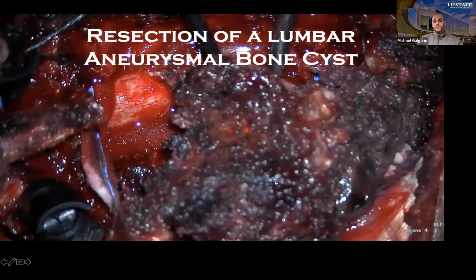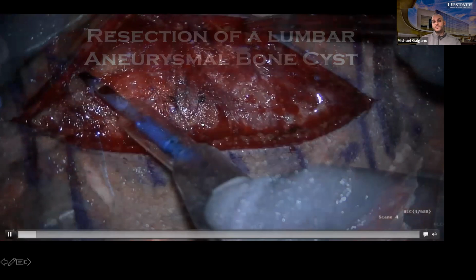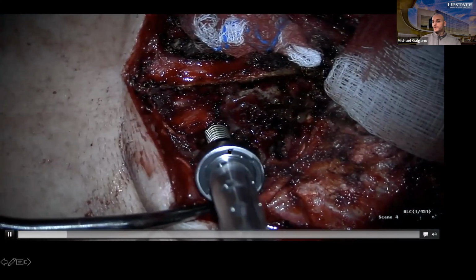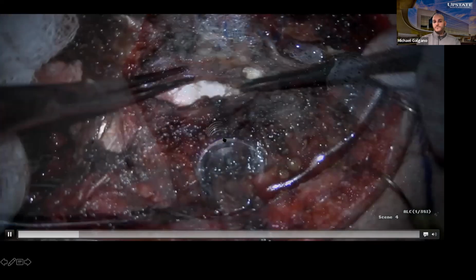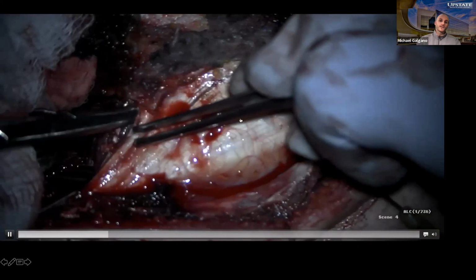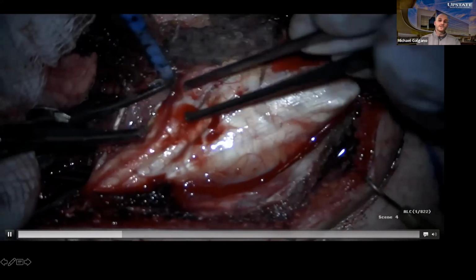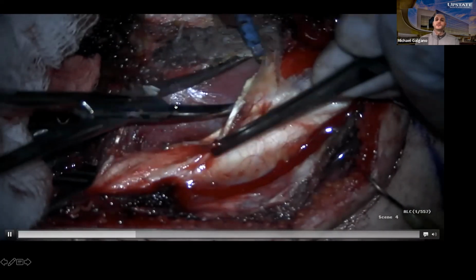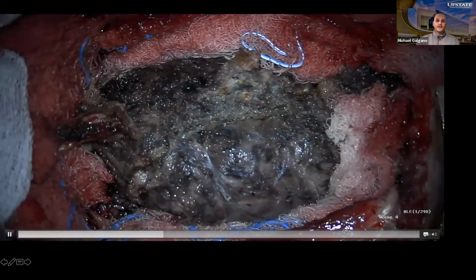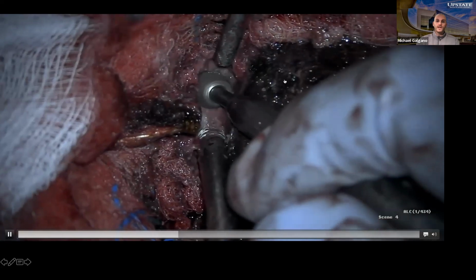I brought in the microscope from the get-go with this case, because what I didn't want to do is throw our cautery into the tumor. And just like Mike Selby said, we decided to use carbon fiber fixation here. This was kind of an unusual approach in that we had to do a lot of meticulous soft tissue dissection, a lot of muscle splitting just to get through this. So we finally find the capsule of the ABC, and then we basically got an Aquamantys. We cauterized the heck out of it.